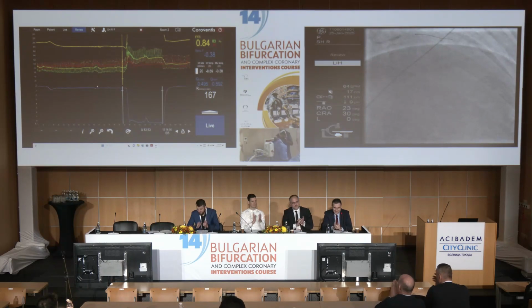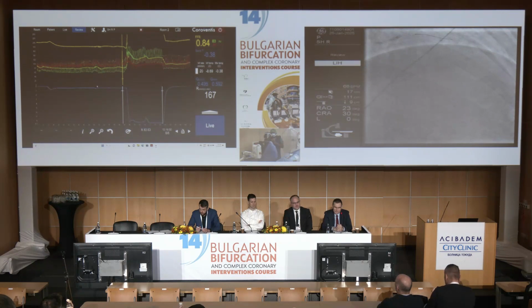Thanks. And I think we can already say like this to the patient, that he can forget completely about microvascular disease. You remember that the IMR was 24. We said, it's a little bit high. Borderline, let's say. You know, when you have a microvascular resistance of 167, which is way below the value of 450, you can tell him, look, guy, there is really nothing special with your coronary arteries, except a little bit of atherosclerosis. You have to be careful. But the microvascular function is strictly normal.